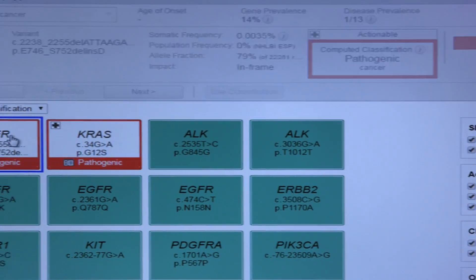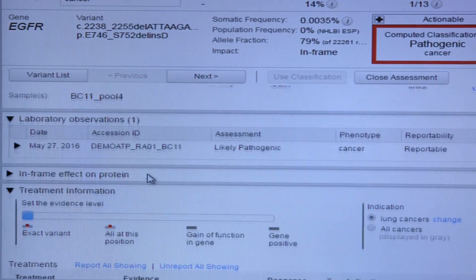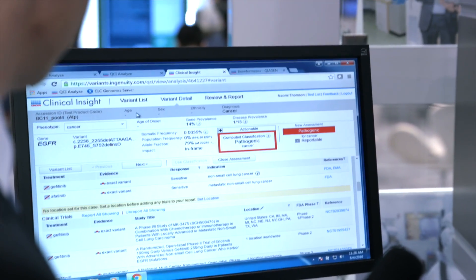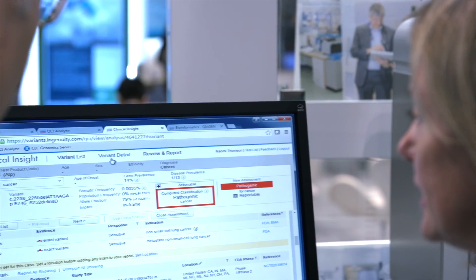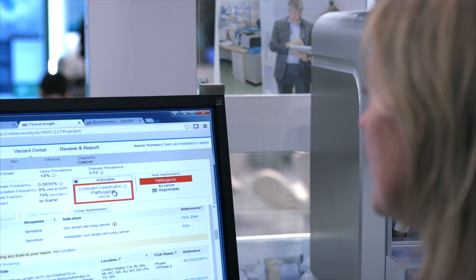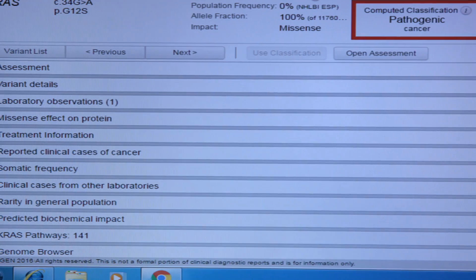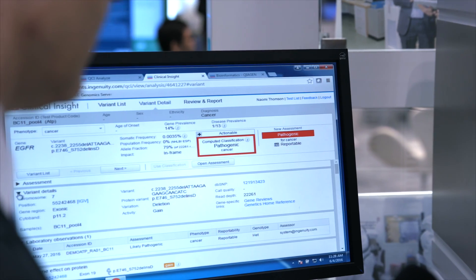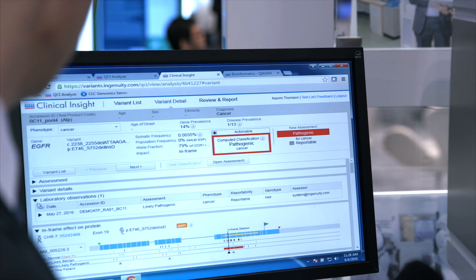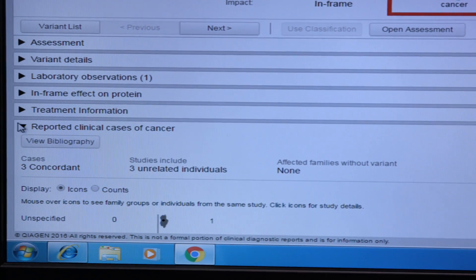So if I double-click on this variant, I can see there's a lot of information available here. I'm now in the variant detail. I can see information about the gene prevalence, the disease prevalence. This is my computed classification that I was talking about. And I can also create a new assessment. All of these can be toggled open and on and off, so you can see different levels of information about your variants.